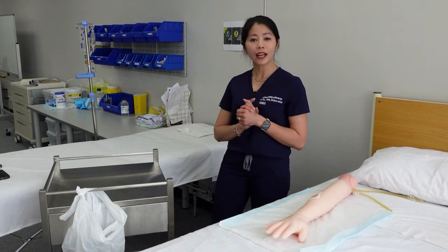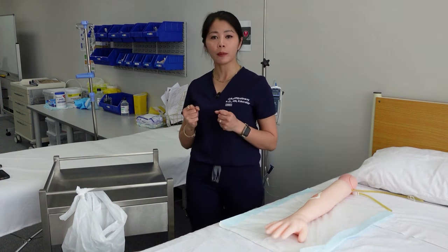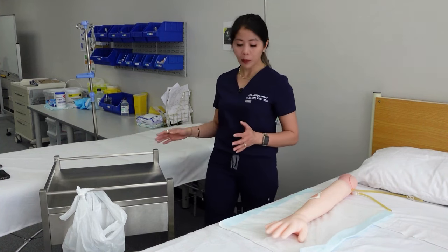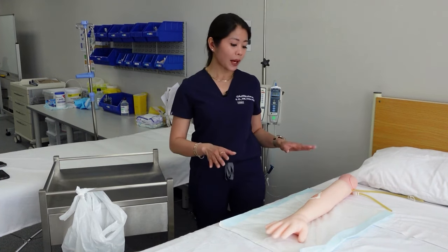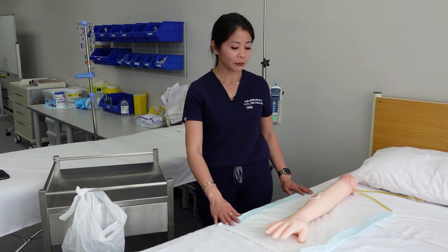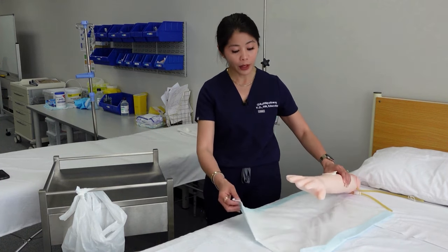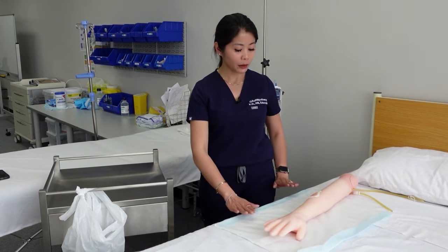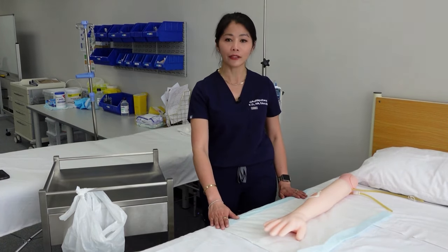When you get the equipment, you have to check the expiry date as well. Once you're prepared, make sure the patient is comfortable and ready for you to do the dressing. You might even put a bluey underneath the patient just to keep the bed nice and clean after your dressing.